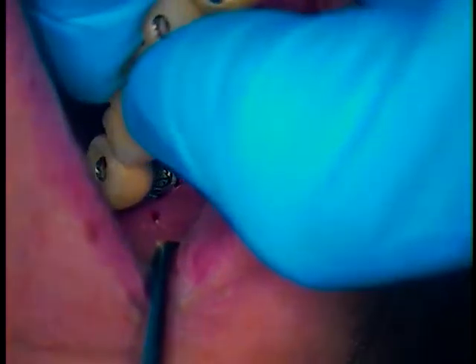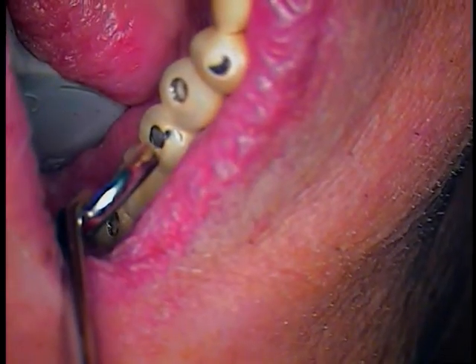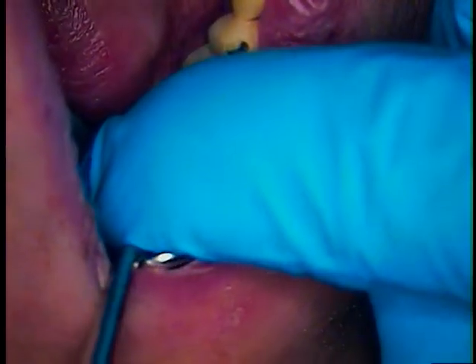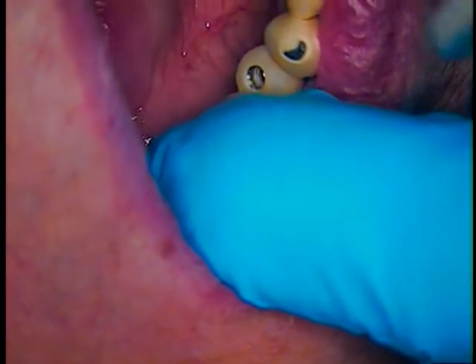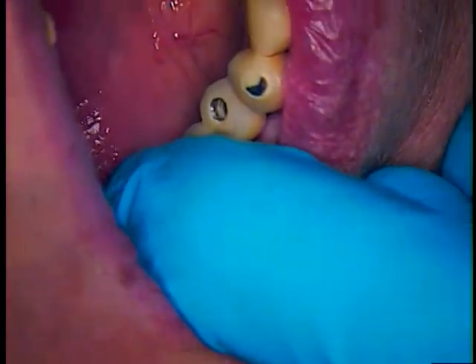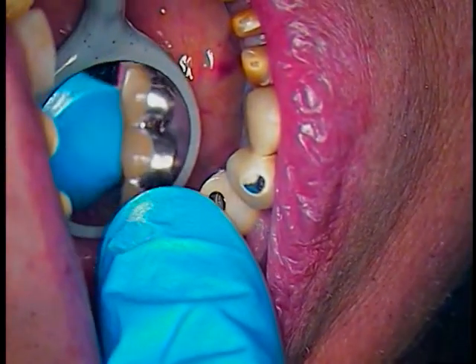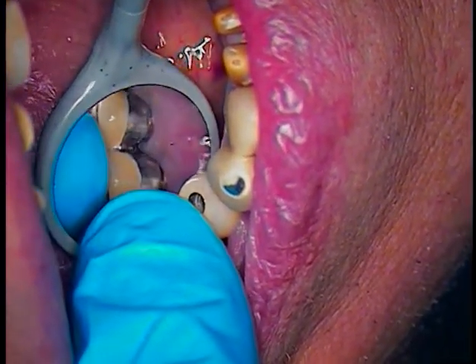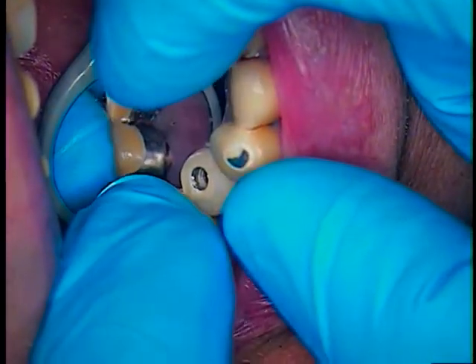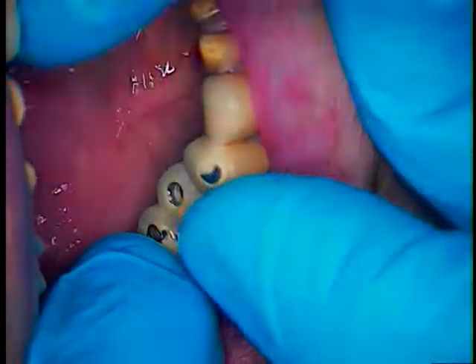There it goes. Looks good. Perfect. That confirms the angle — now all we have to do is lock it in. If I can grab that mirror again, I'm going to double-check the other two to see if we're in. Height was important when we were ordering the parts — we were measuring heights, making sure that all worked out.